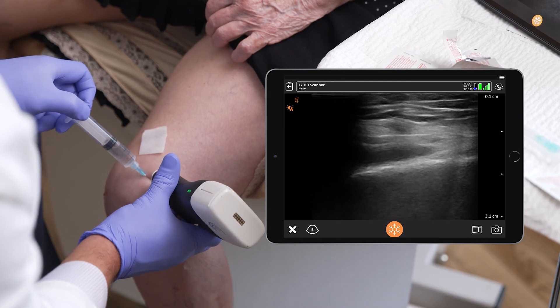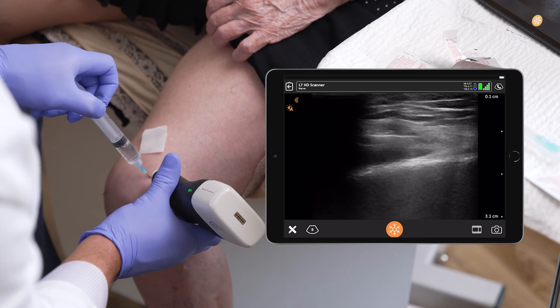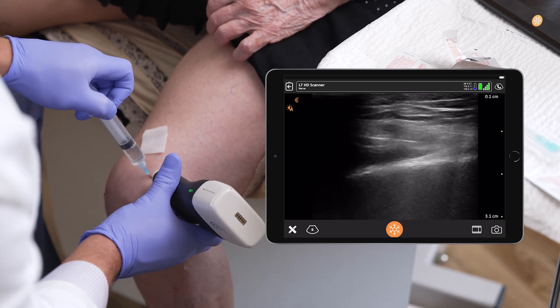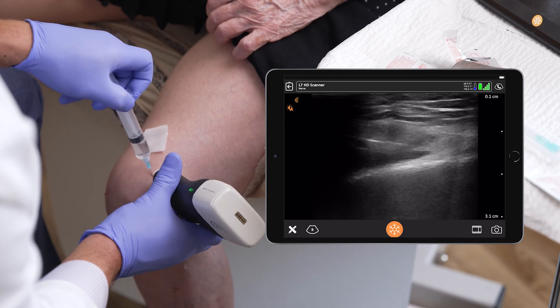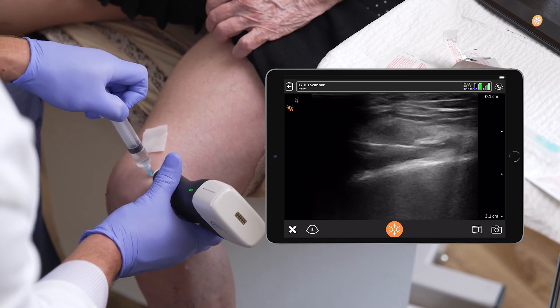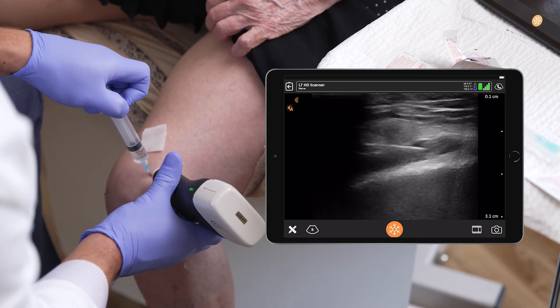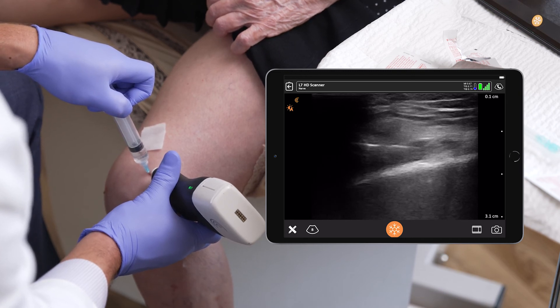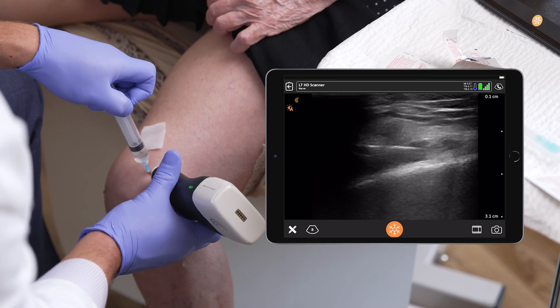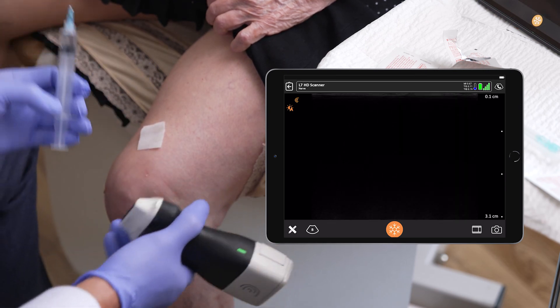There's a picture of it. I'm going to get the needle slightly lower — we're going to have to target the nerve underneath it. That's the nerve right above my needle. The artery is to the left of it. Much easier to see after the local anesthetic has been given. This is the lateral genicular nerve, one of the three branches that gives innervation to the knee joint.